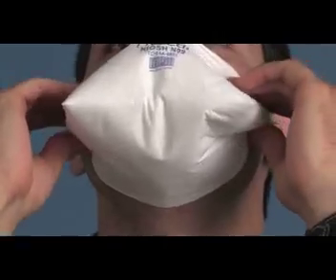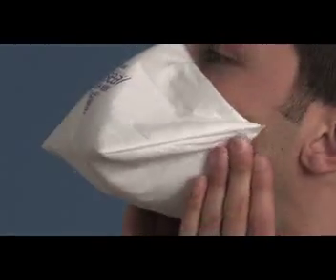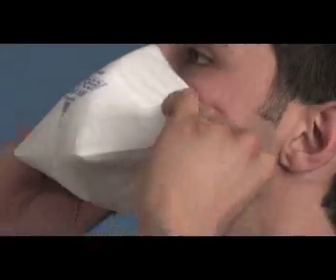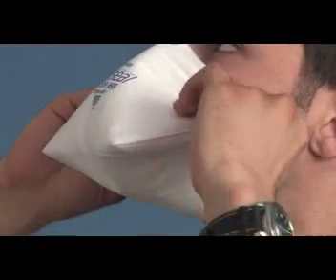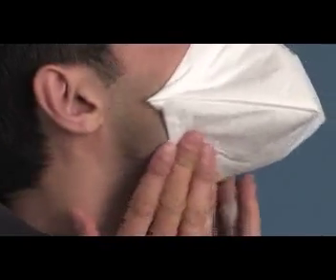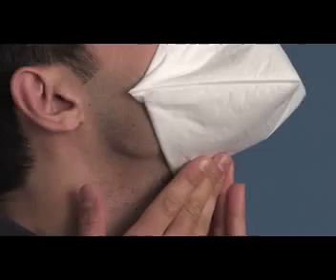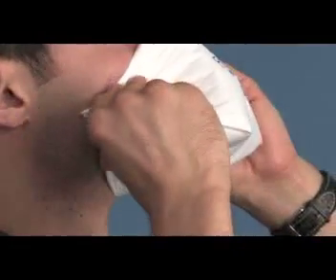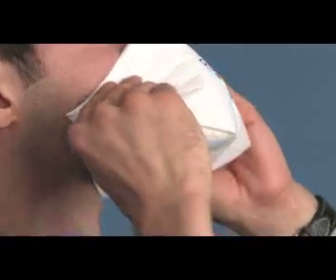Press down firmly to form a smooth seal. Using the fingertips from both hands, pinch the top and bottom layers together and press firmly against the cheeks. Open mouth wide to stretch the material into position to form an adhesion seal between the respirator and the face. Press firmly all around the adhesion portion of the respirator to ensure that there are no gaps or wrinkles in the material.